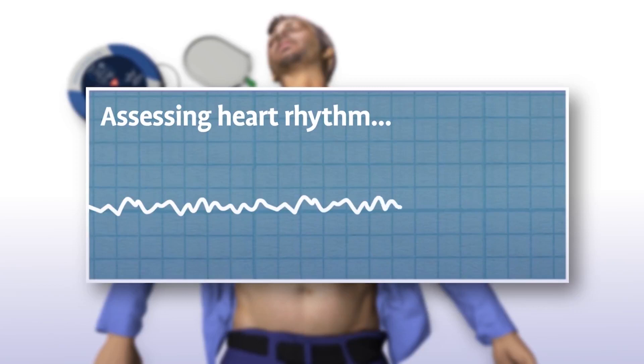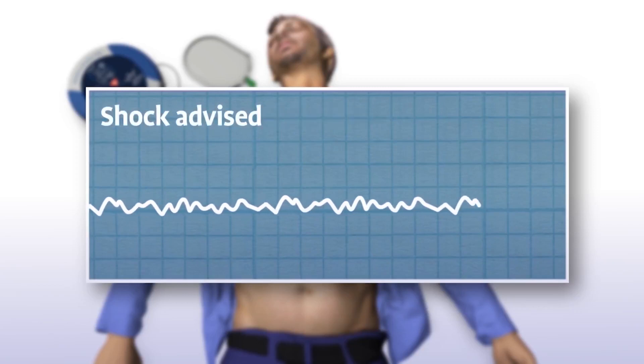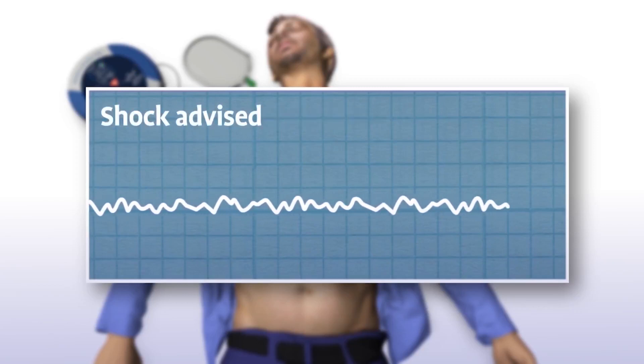The Samaritan PAD automatically assesses the patient's heart rhythm. Assessing heart rhythm — do not touch the patient. It then recommends whether or not a shock should be delivered.